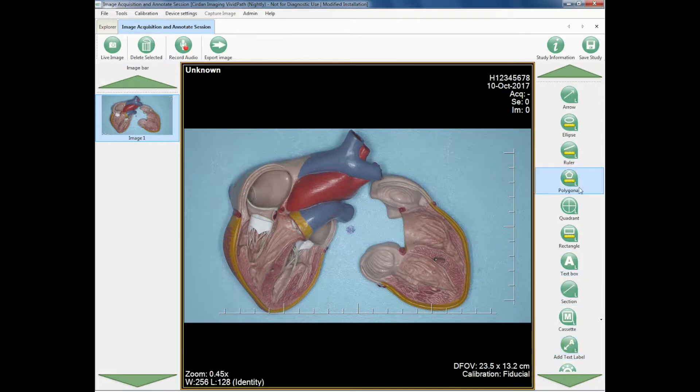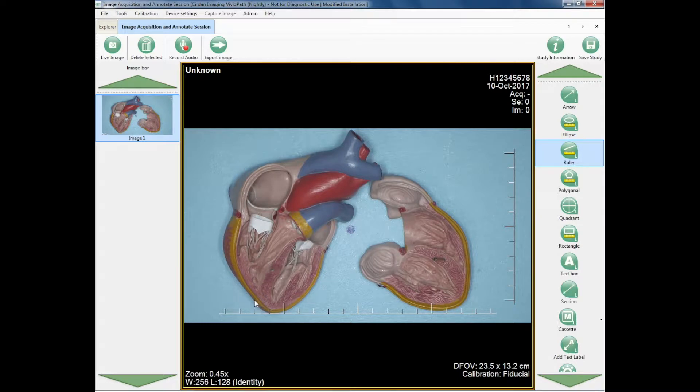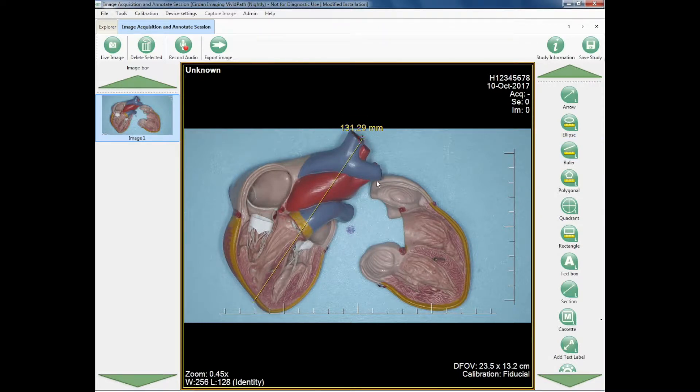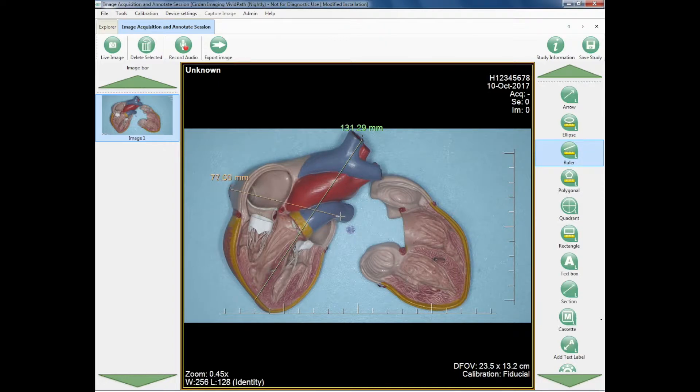So for example, with these tools, I might want to make a measurement and I can measure the image of my sample end to end, or I can measure it, for example, across.